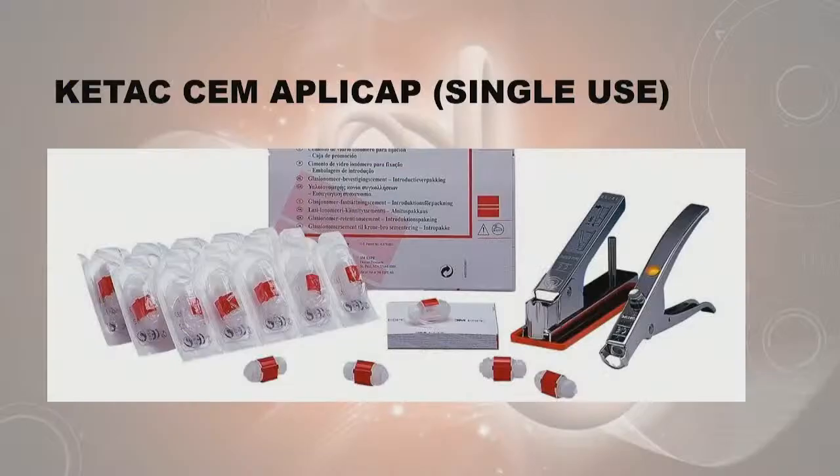It's a once-off use. You need to get all these applicators. You also need a centrifuge in theatre, which is not really practical. But the problem here is the consistency of the cement that comes out is a little bit too much like putty. And we want sort of a wet toothpaste kind of consistency to be able to work with the ossicles. And you'll see now in some of the videos.